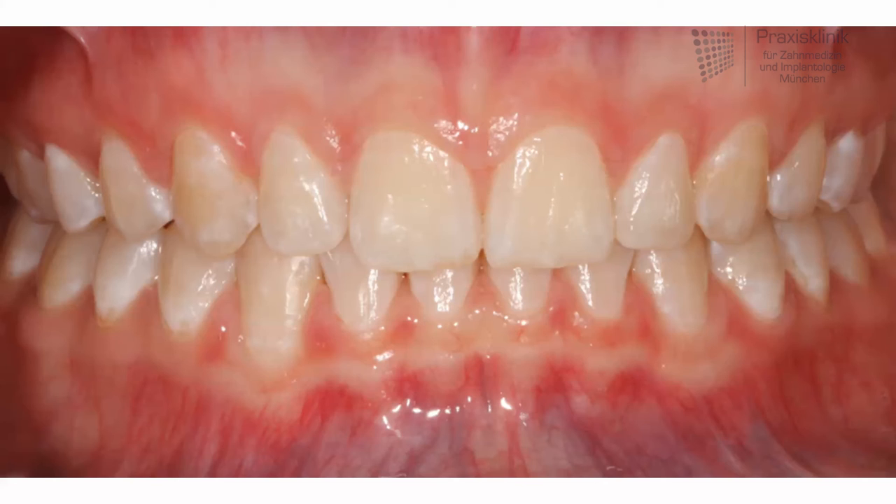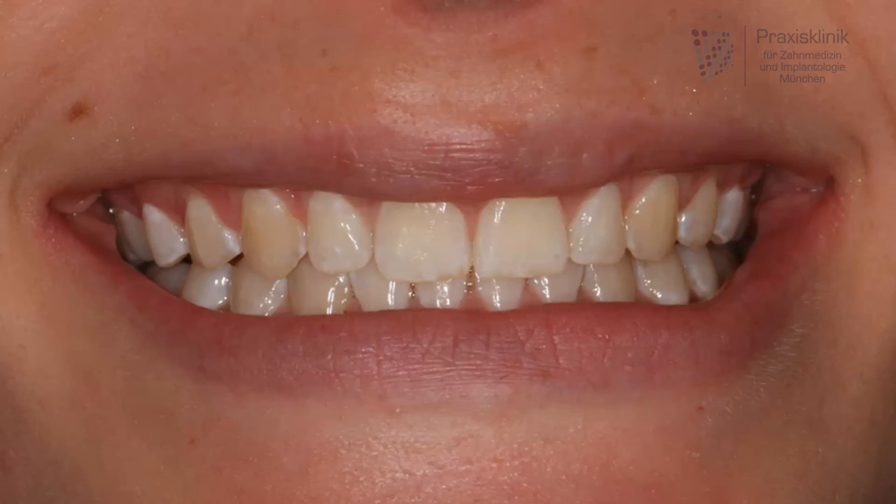We do that with the use of splints similar to your night guard which change every two weeks. With these splints the teeth are moved between 0.1 and 0.2 millimeters every week and slowly put into position. And additionally, like we said, we do not need to touch your teeth for that at all.